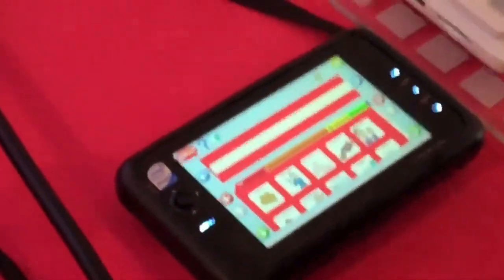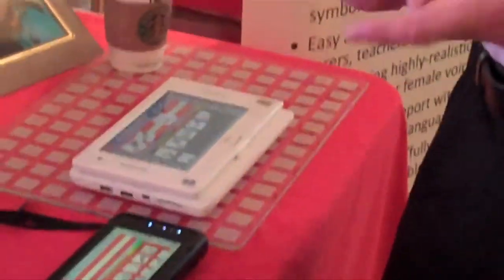Again, what we've tried to do is offer it in a range of different sizes. My son only weighs 3 stone, so about 20 kilos. Yes, even though he's 11, he's very thin. So trying to give him a big, heavy, bulky device to carry around is not practical. Sure. He's got good fine motor and gross motor skills and visual acuity, so giving him a portable device that's 5-inch that he can carry around fairly comfortably, then that's great.